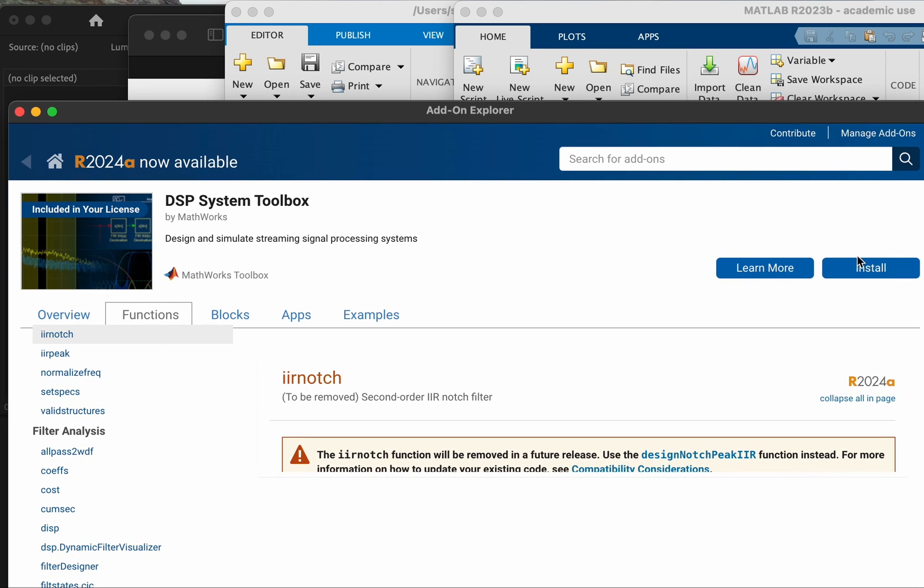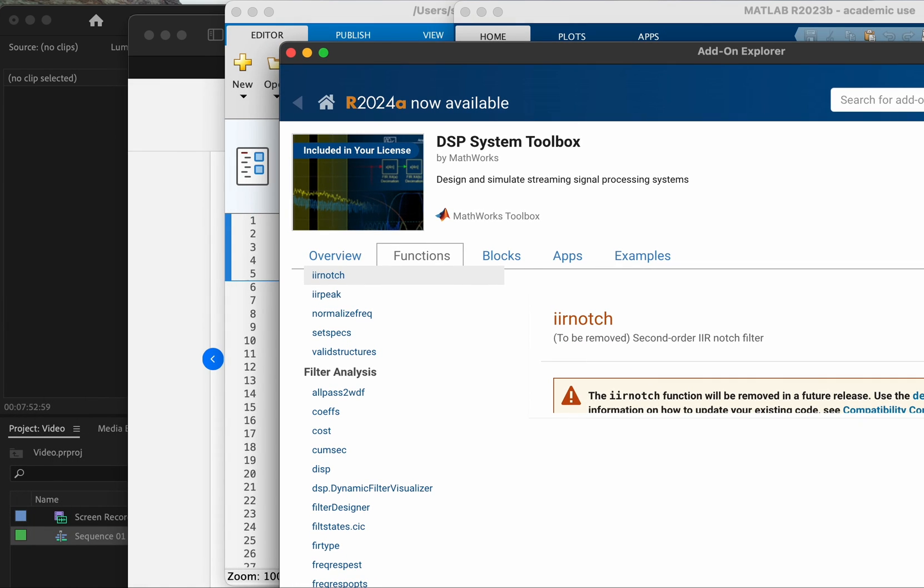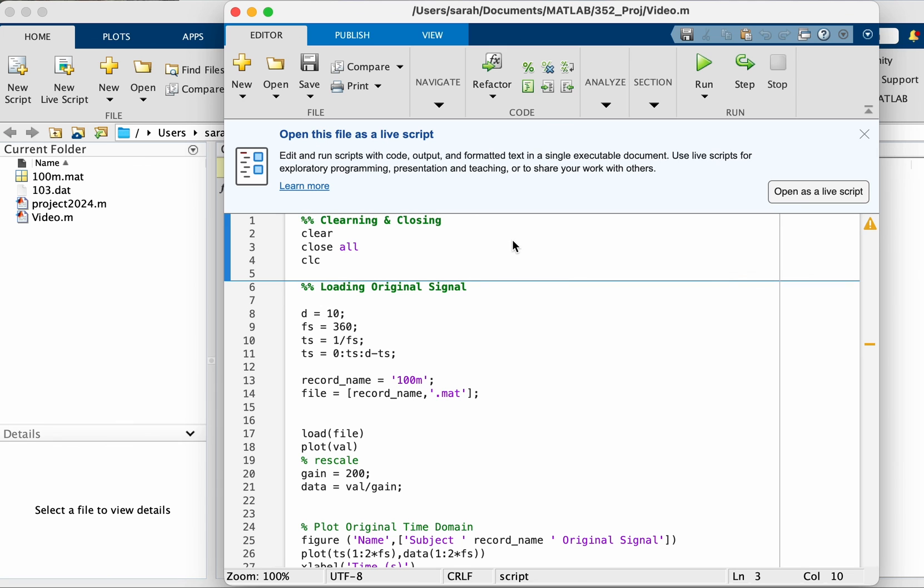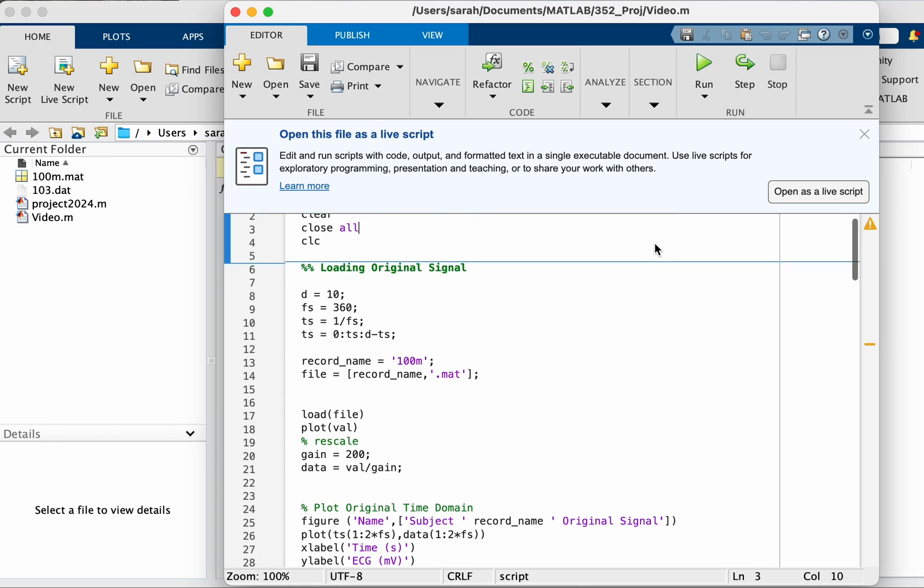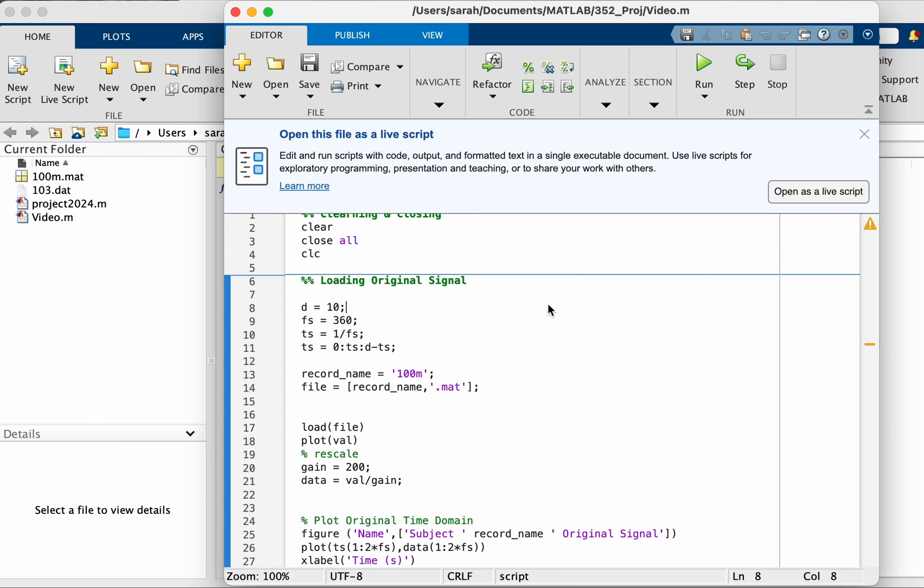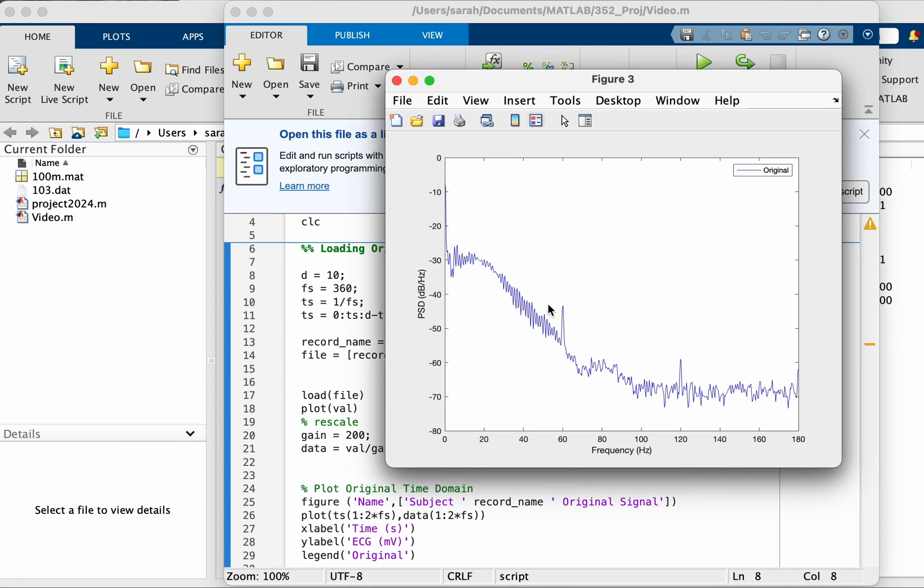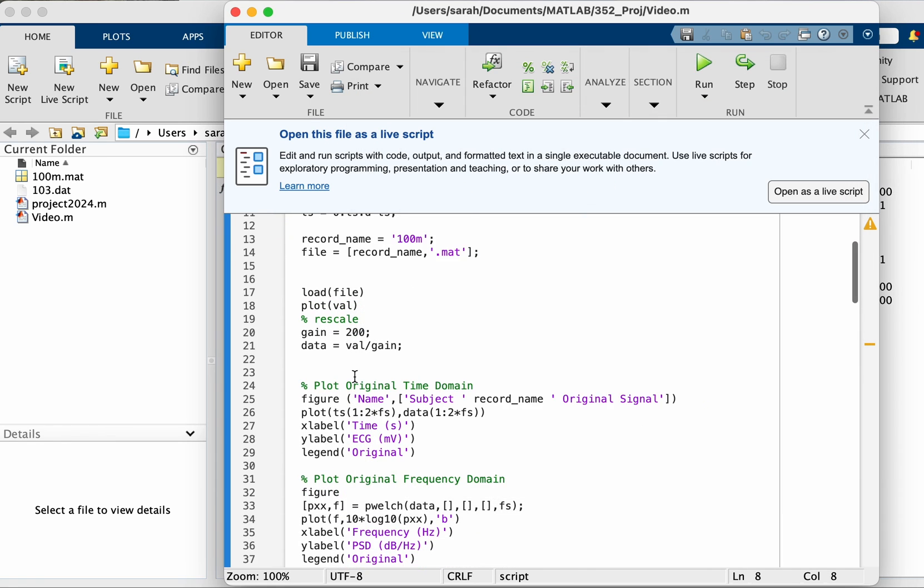Let's go ahead and install it. Okay, so I'm going to hit install and then log into my account. Okay, we are back now with the DSP toolbox installed.